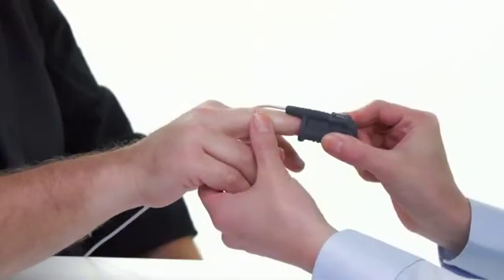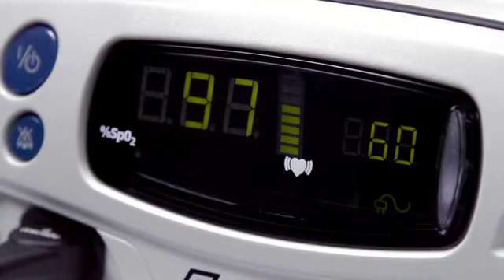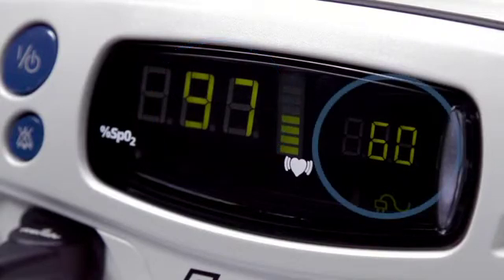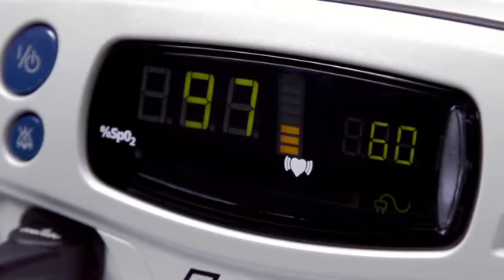After the start-up sequence, the oximeter will start displaying and recording SpO2 and pulse as soon as the sensor is placed on the patient. The SpO2 level is shown on the left side and the pulse rate on the right side. The pulse strength signal bar in the center indicates the signal quality.